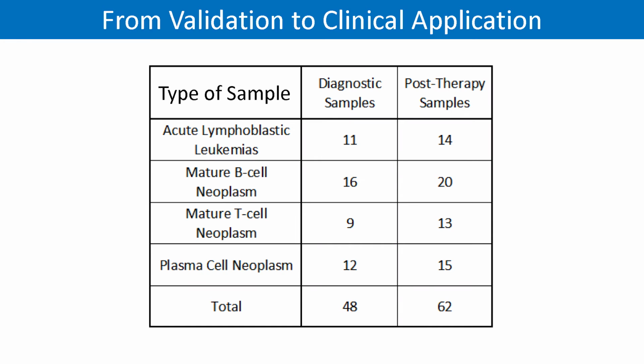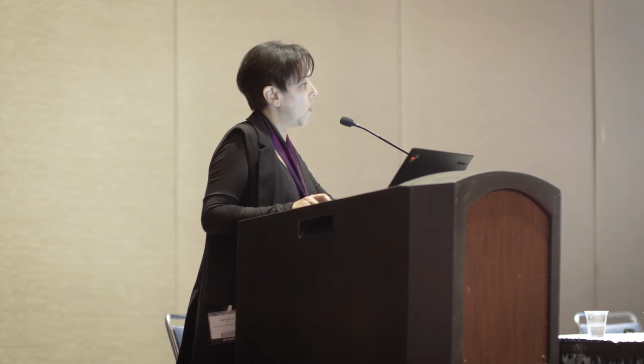So how does this actually translate with real clinical samples? In the validation, you usually work with samples that have ample material. But when you run into clinical samples, you may not have that perfect material that you wish you had all the time.